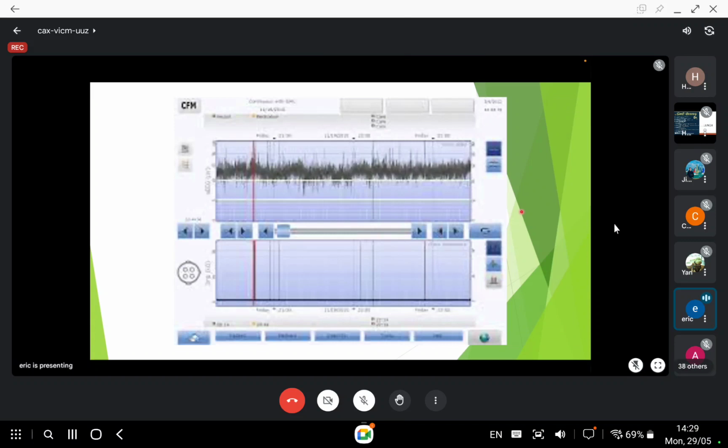So we just comment on these 3 components as Dr. Eric said, like impedance first, because this is quite new to us, we just recently had the aEEG. That is the systematic approach. Correct. That is how I do it. I'm not sure whether that's how other people do it or not.